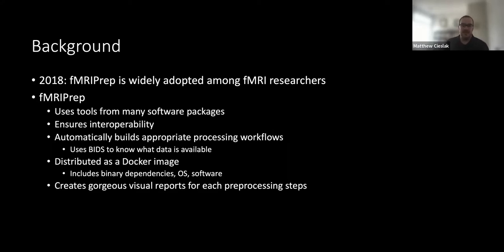So it was a very large Docker image that packaged FreeSurfer, FSL, AFNI, C3D, ANTs, all including the Python installation, inside of one image that people would download and run either through Docker or Singularity on a cluster. But that solved one of the main problems that these previous pipelines would have, which is that users were relied upon to install many different kinds of software on many different kinds of systems. And this led to a lot of very, very difficult to debug issues. So by including everything in one Docker image, it's good for reproducibility, but it's also very good for ease of use and ease of debugging.